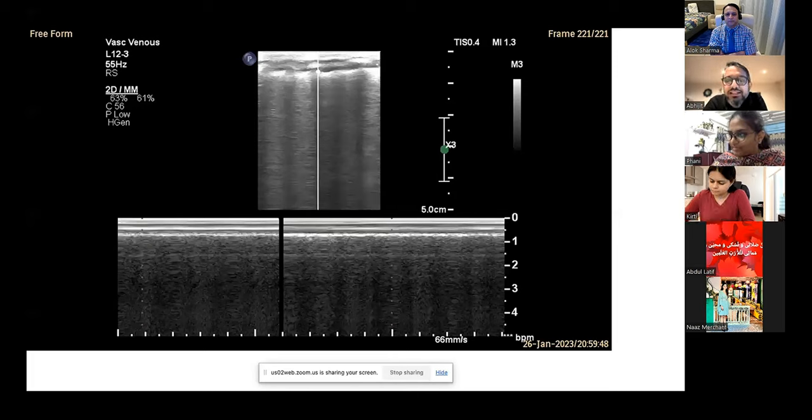That's one thing. And I think the second thing I would have done in this particular image is about the gain. Now I really can't say how much it should have gone up or down, but first thing is the focus. And once we keep the focus, it auto adjusts most of the time. And if it doesn't, then you have to sort of tailor it to get the best of the image there. Otherwise, lovely image.